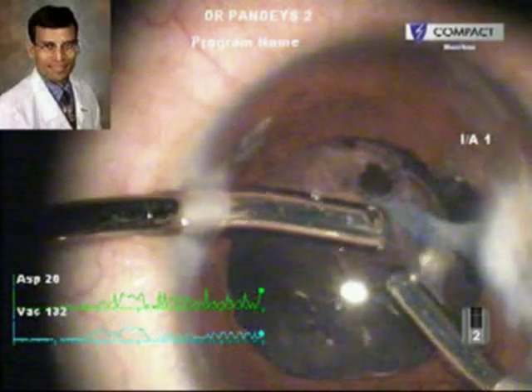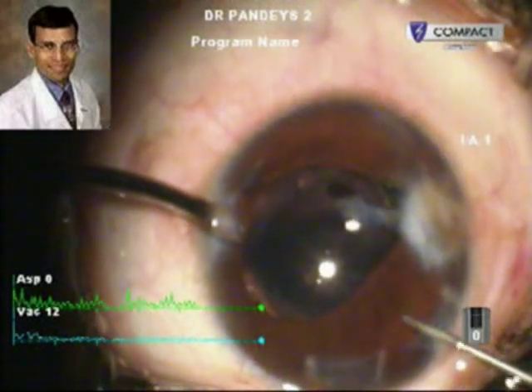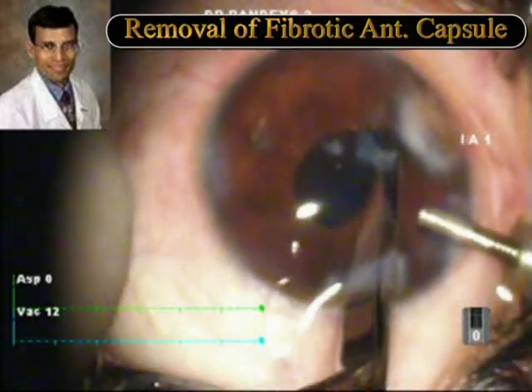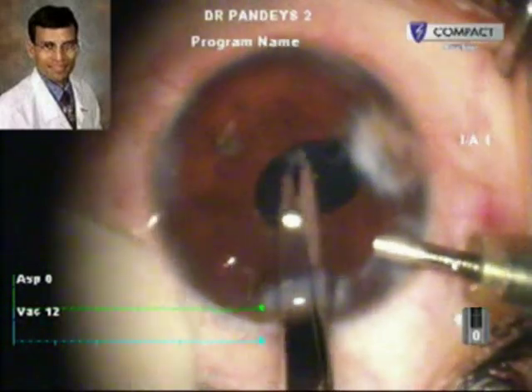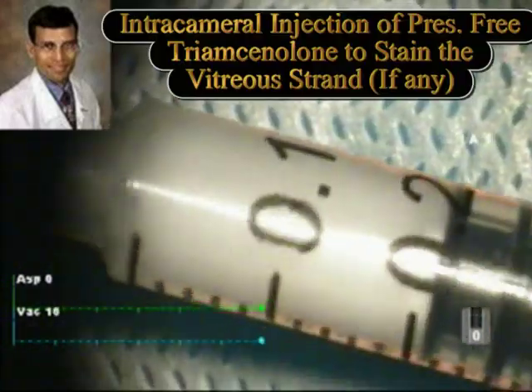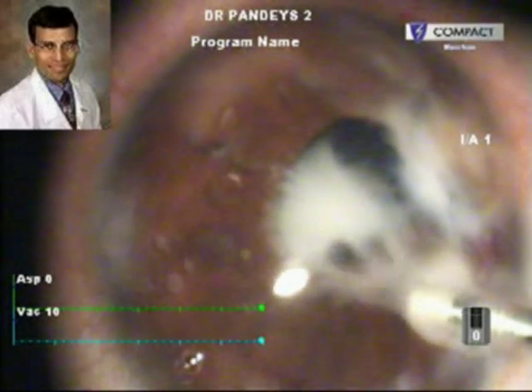Because we used both Viscoat as well as Healon 5 in this case, it was very essential to remove the viscoelastic completely. It was felt that the fibrotic anterior capsule edge was coming into the visual axis, so it was also removed using a Vannas scissor so that the visual axis could be cleared completely. Here, as you can see, the fibrotic anterior capsule has been removed and the visual axis is cleared.